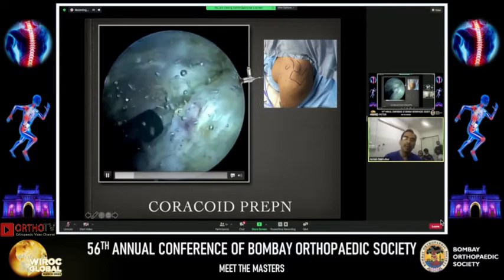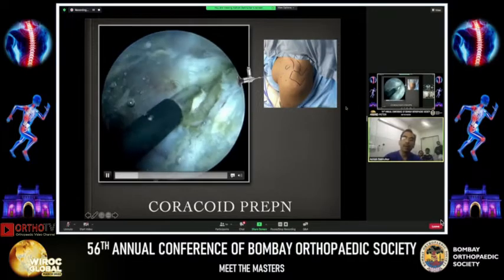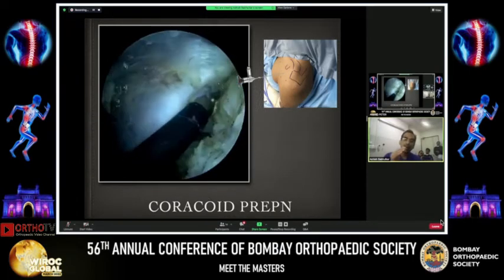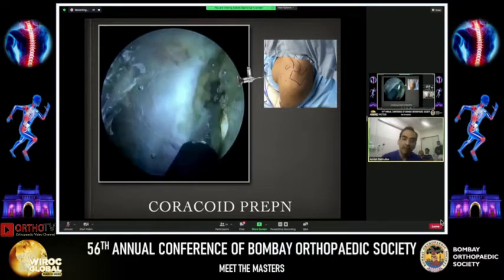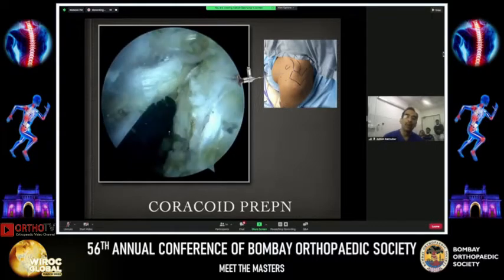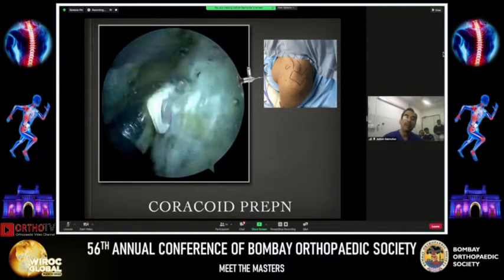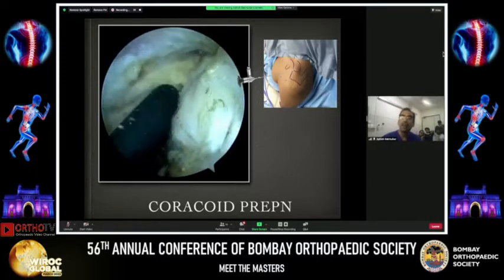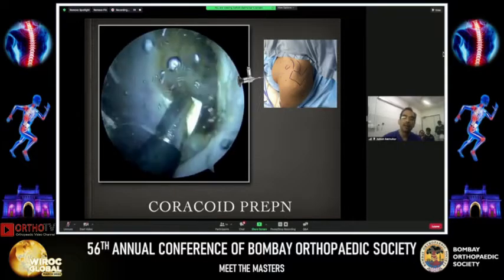I'm proceeding to resect the medial part of the coracoid, which is the pec minor tendon. With the radiofrequency hugging the coracoid without going medial to the pec minor, because that is where the musculocutaneous nerve is. We need to go a fair bit down to free up the coracoid because a lot of the pec minor merges with the conjoint tendon. One has to be very careful not to harm the conjoint tendon because that is very important to our dynamic stability in the Latarjet. It is mandatory in this procedure to identify the musculocutaneous and the axillary nerve — the two critical nerves.